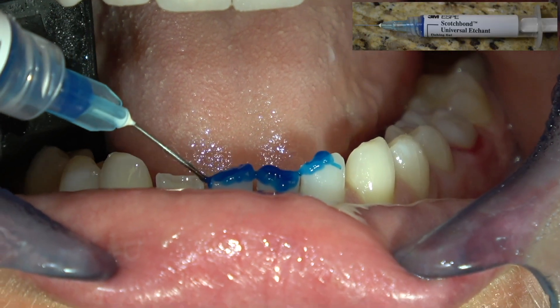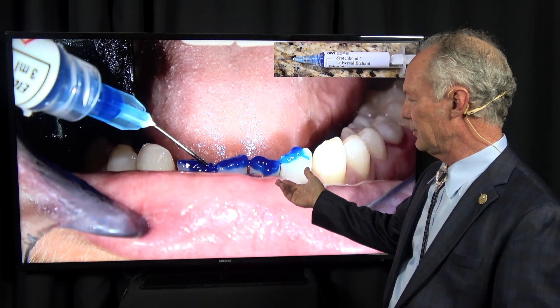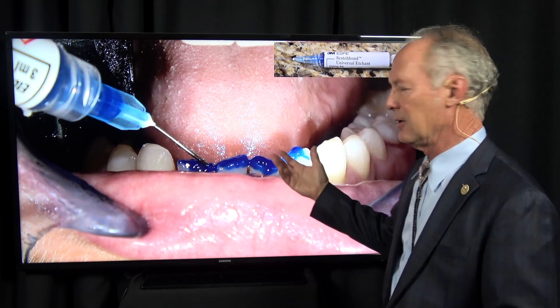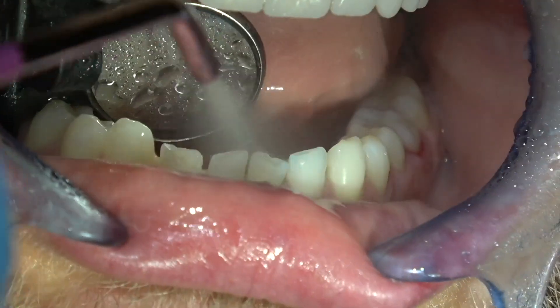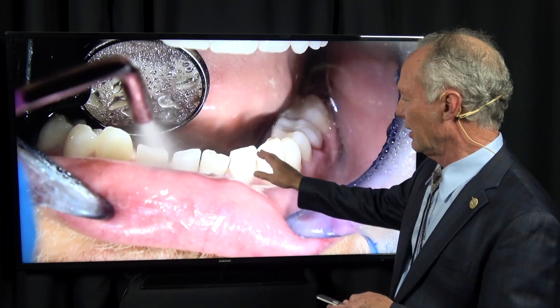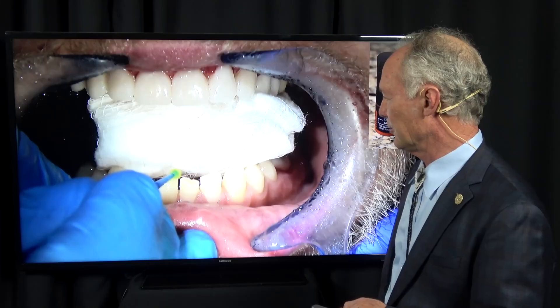We're going to etch these areas — typically 15 to 20 seconds for dentin, no real limit on how much you can etch enamel; normally I'll etch enamel for 45 seconds to a minute. If you've got dentin and enamel, etch the enamel first and then place dentin etch. Since we're not worried about bleeding here, I'm rinsing that off with my air water syringe.